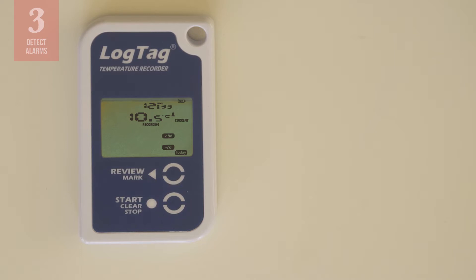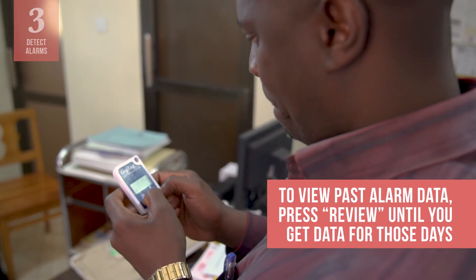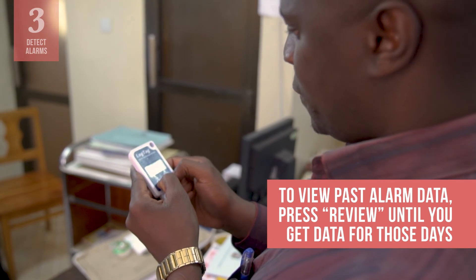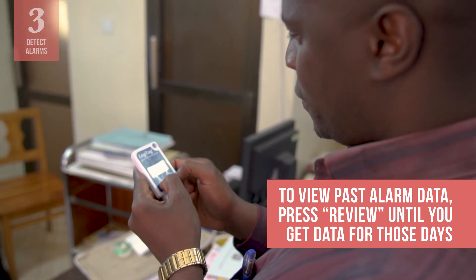Like other 30DTRs, the log tag records all the heat and cold alarms for the past 30 days. The days that alarms were triggered are shown here at the bottom of the display. You can see that, in addition to today's alarm, an alarm was triggered 7 days ago and 19 days ago. To view past alarm data, press review until you get the temperature data for those days.